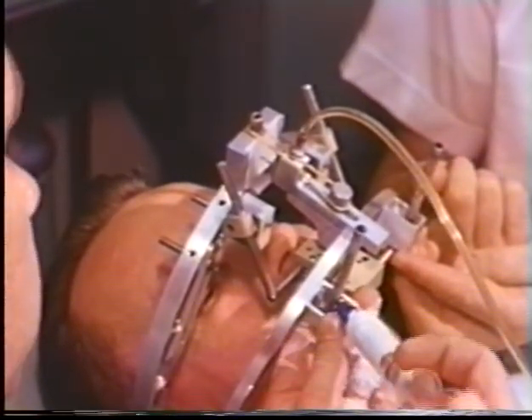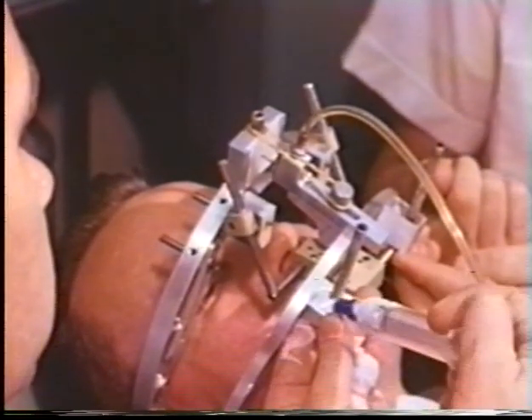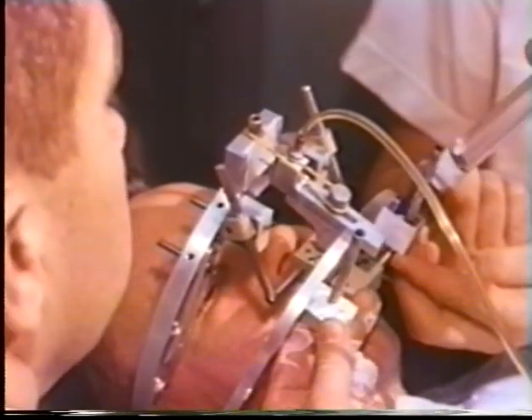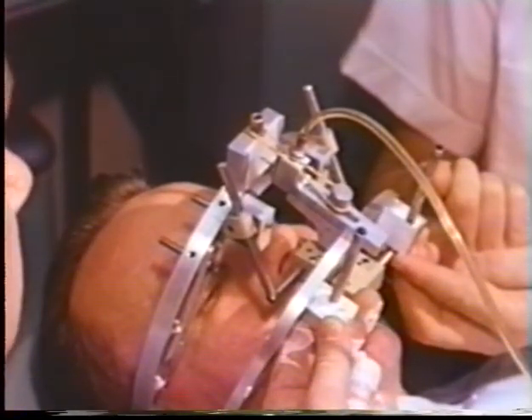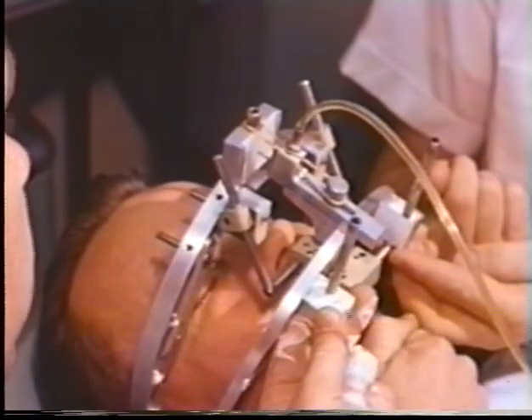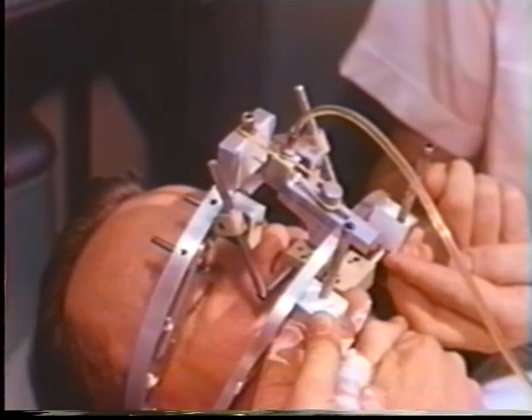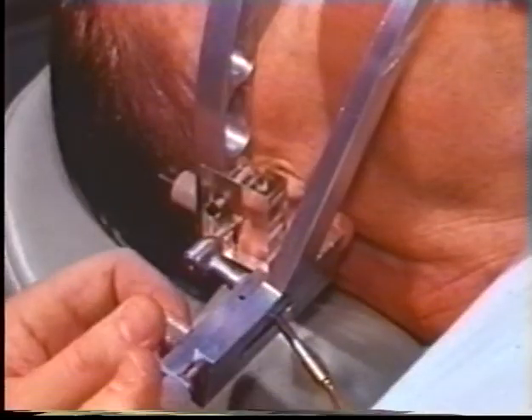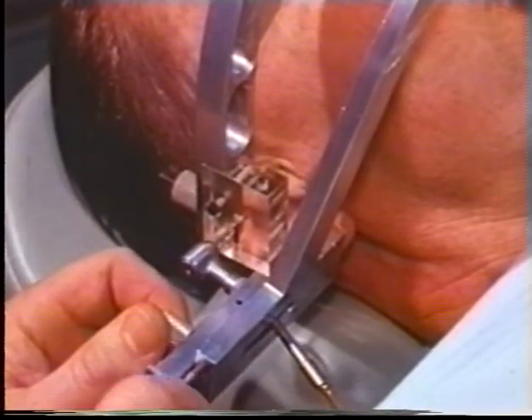Plaster is placed in the tubes to attach the bow solidly to the mandible. The mandible is retruded several times and finally held in centric relation while the plaster sets. The hinge axis of the mandible has now been made collinear to the axis of the recording drills.